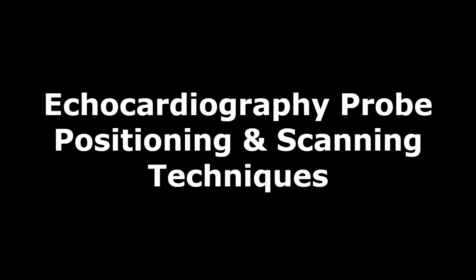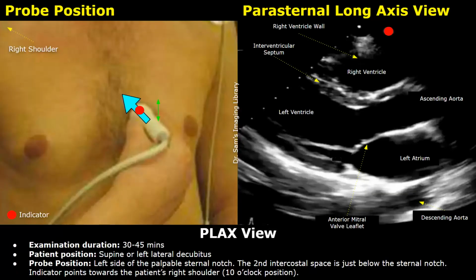Hello everyone, this is Dr. Sam, and today you will learn about echocardiography probe positioning and scanning techniques. The image on the left will show the patient position and the ultrasound probe placement, and the right image will show the ultrasound image that is formed.